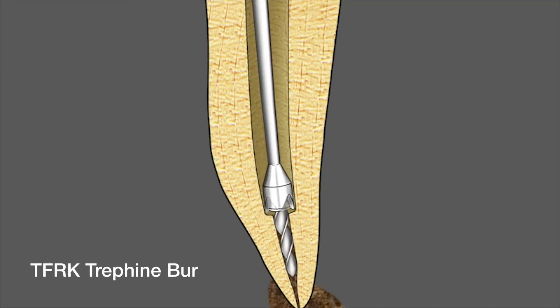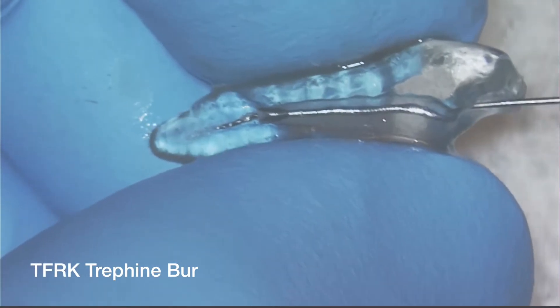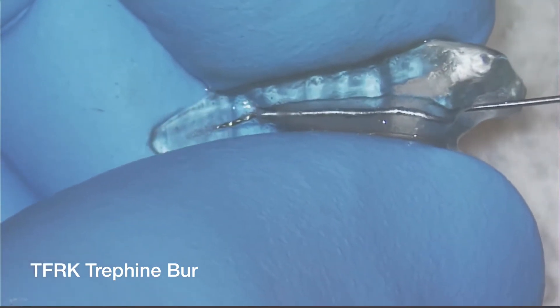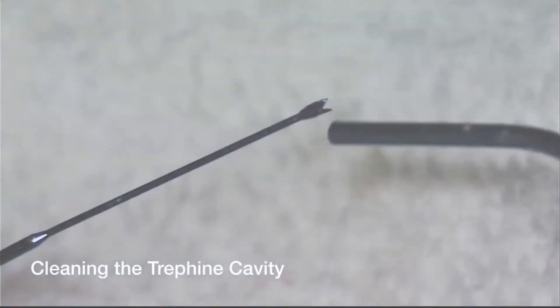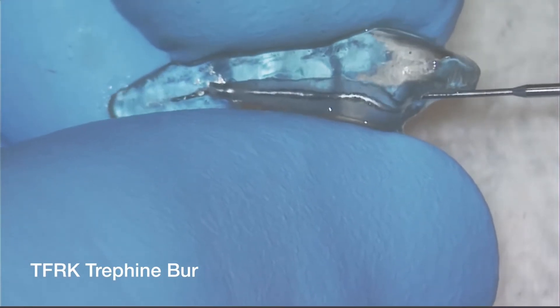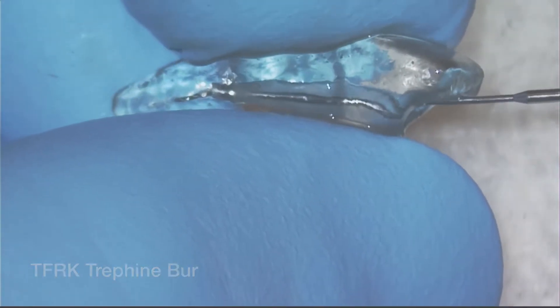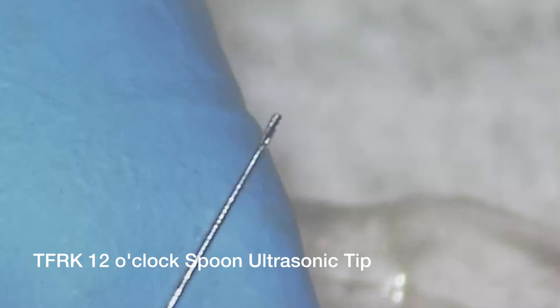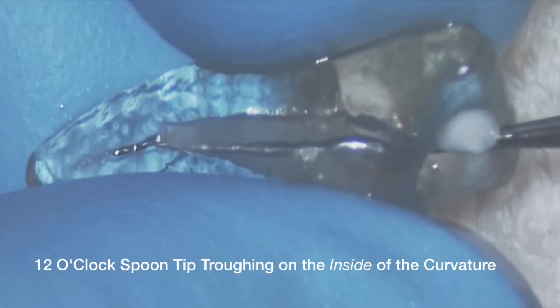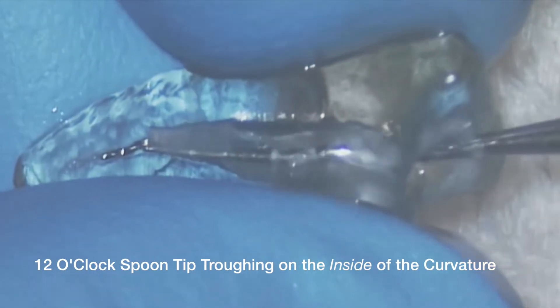You can see the animation here showing that occurring, and here it is in the replica. It's used in reverse, and after a bit of use you need to clean the little cavity out so it can cut deeper around the separated instrument. The spoon tips are really cool — they go around the file to deepen the troughing effect. The number six has the spoon shape facing towards us; we're using the number twelve, which is facing away from the handpiece handle.